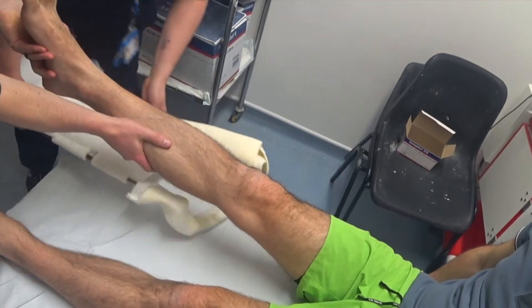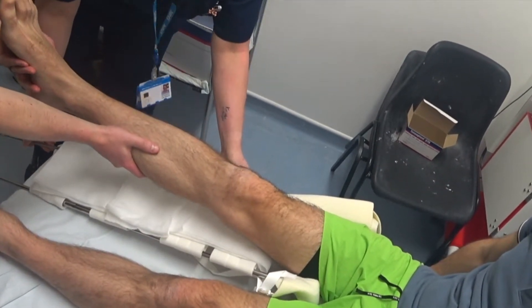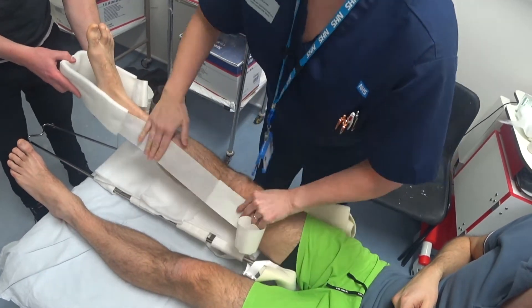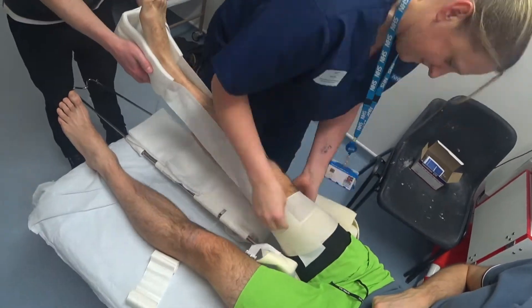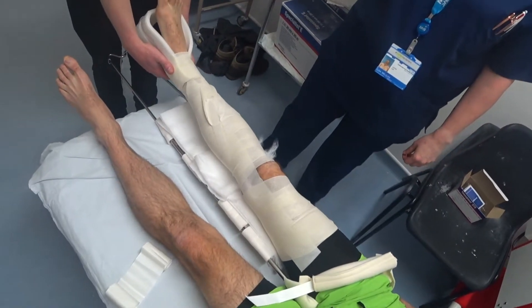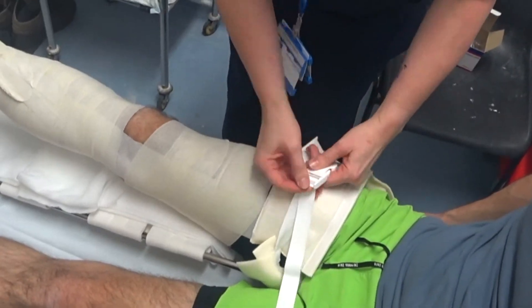At this point, you will need to elevate the broken leg to place the Thomas splint, remembering to check that the splint is not compressing their genitals. Someone will need to hold the leg in gentle traction while the skin traction is applied. If this is too long, it can be cut down to size. The skin traction is then bandaged to the leg from ankle to upper thigh. At this point, you can lower the leg gently onto the splint and secure the hoop with the strap.